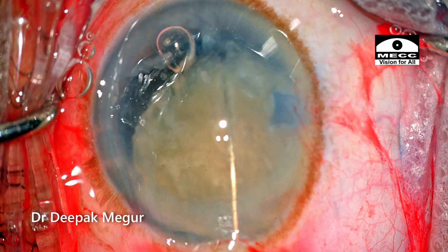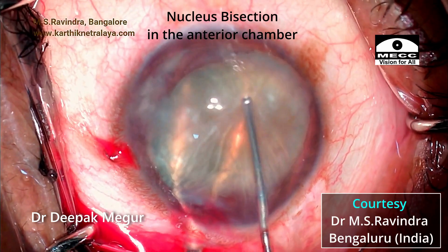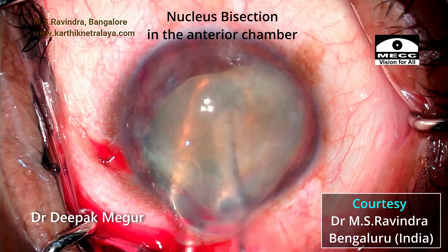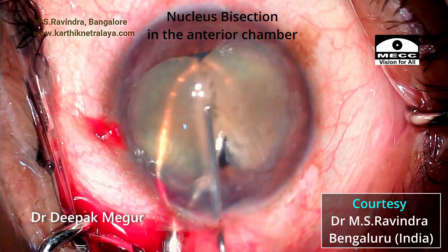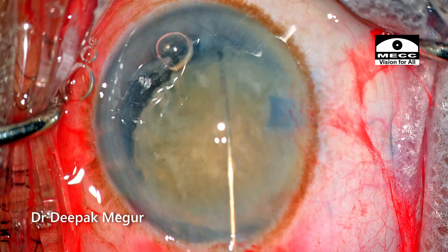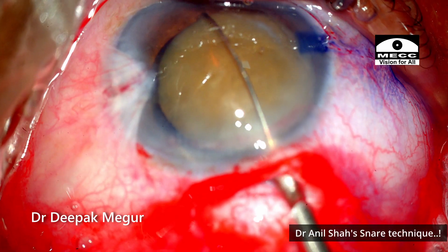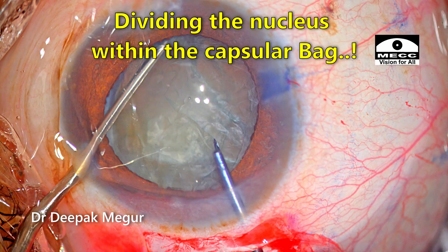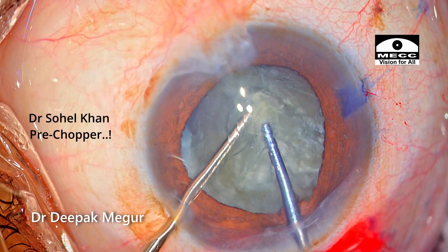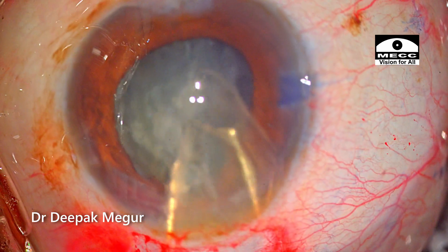There are many ways to divide the nucleus manually. The most common technique is nucleus bisection in the anterior chamber, where a vectus is used underneath the nucleus and a Sinskey hook or cannula is used to fracture the nucleus into two fragments. Then there is the snare technique, wherein a metal wire is used to loop around the nucleus and then bisect it. Lastly, we can also divide the nucleus in the capsular bag itself using certain pre-choppers, and then prolapse the pieces out of the bag and out of the eye.